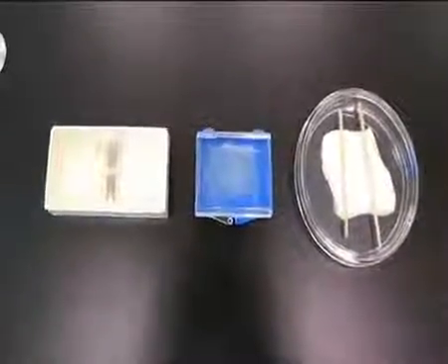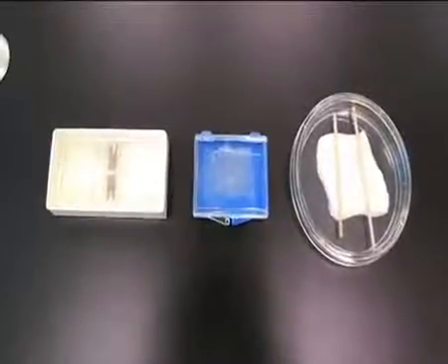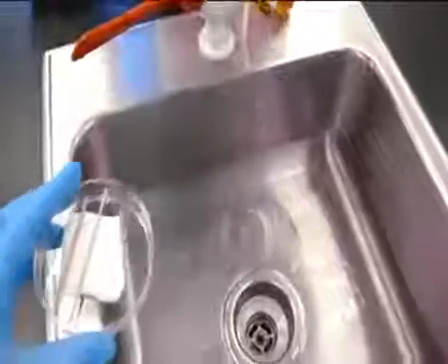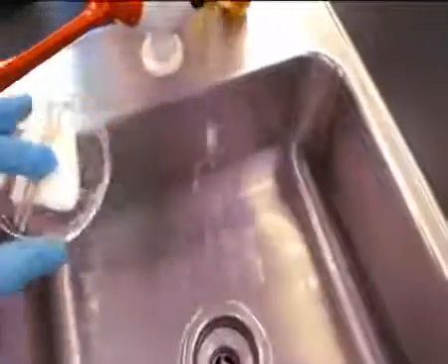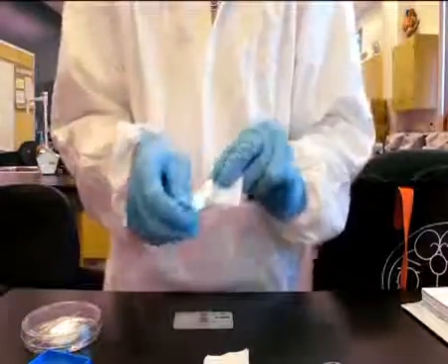While waiting for the solution to mix, obtain the following materials: a hemocytometer, a cover glass, and a humidity chamber. Wet the gauze in the humidity chamber by placing a few drops of water on it. The hemocytometer and the cover glass should be cleaned first using an alcohol swab.